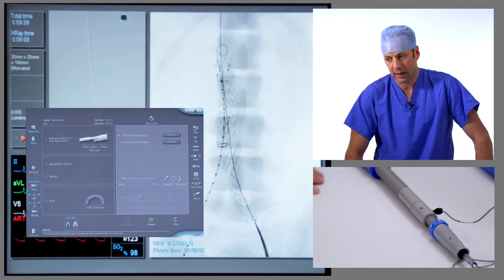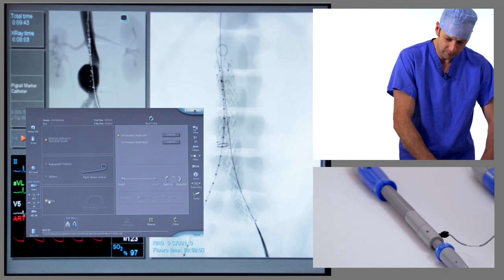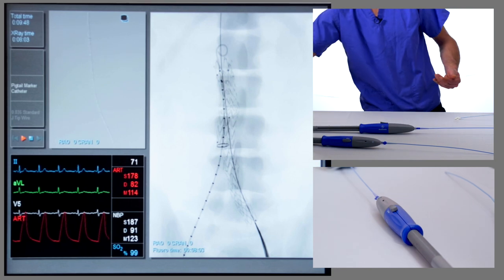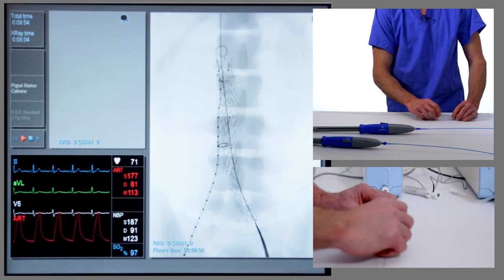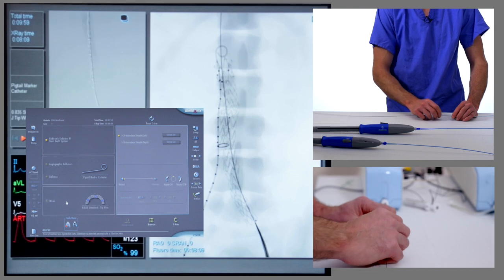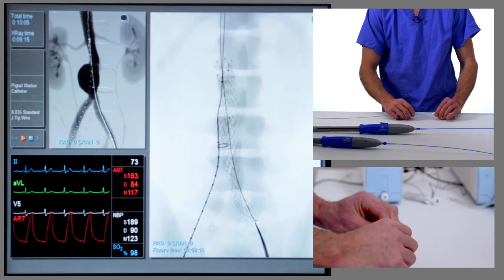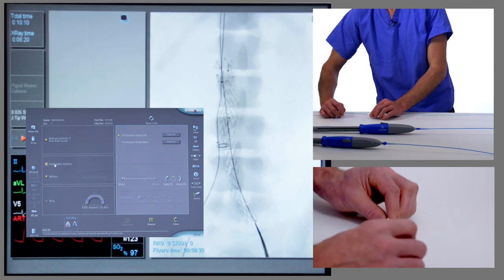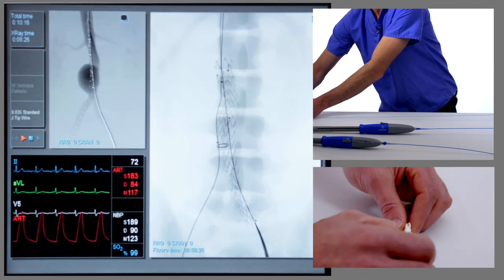The next step is to catheterize the contralateral limb gate via the right hand side. We remove the pigtail catheter over a J-tipped guide wire inserted up through the right groin and through the pigtail catheter. We'll see the pigtail catheter straighten out, then remove it and replace it with a simple shaped catheter — something like a vertebral catheter, though there are other alternatives that work well.